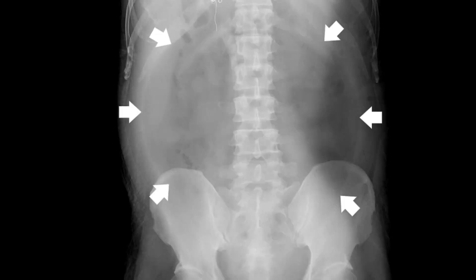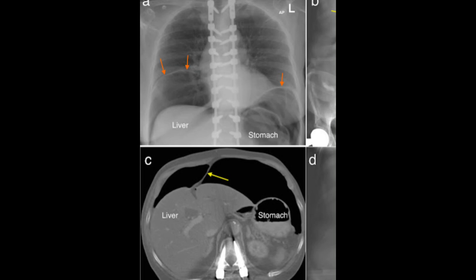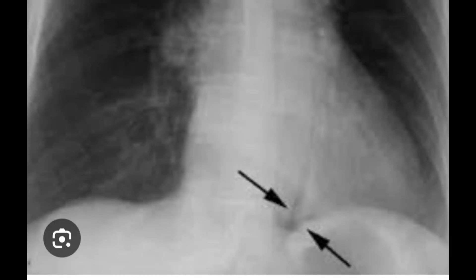Pneumoperitoneum can also be identified by peritoneal ligament signs. On the abdominal radiograph, the football sign indicated by the white arrow is pathognomonic for pneumoperitoneum and is caused by the peritoneal ligament sign. The falciform ligament sign can be seen on chest X-ray and CT abdomen — the red arrows indicate it on chest X-ray, and the yellow arrow on CT abdomen.